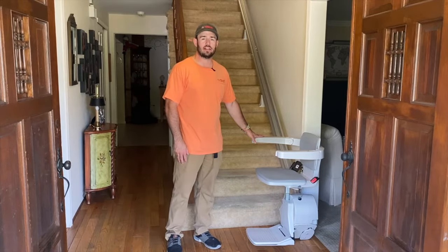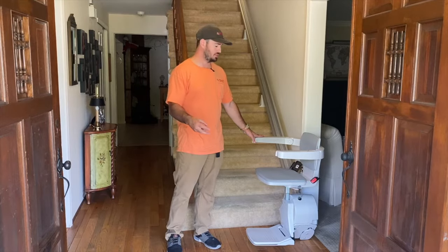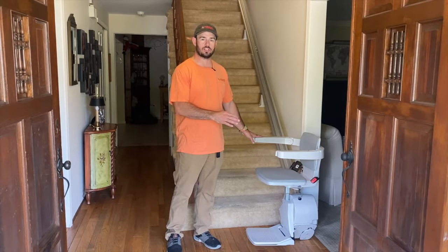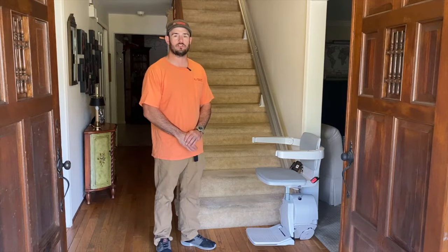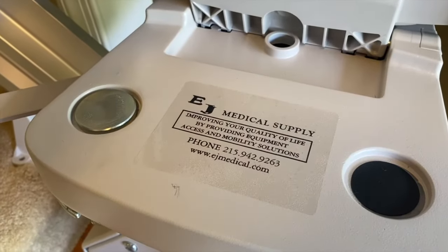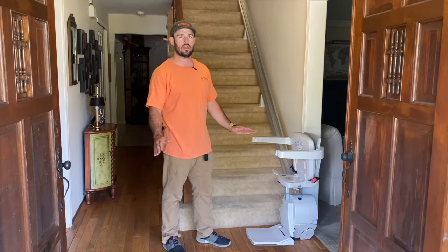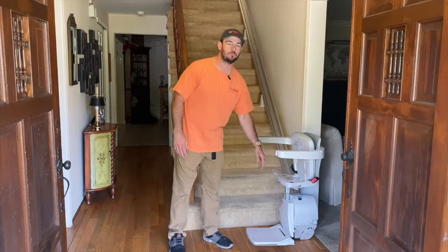With this stair lift there is a lifetime warranty on the major components, including the motor, transmission, track, and gear rack. If a part fails within your time of owning the stair lift, the part is fully covered. Anything installed within the first year — we fully cover the service of the stair lift. We put a big sticker right underneath the seat with our phone number on it, so if you ever have any questions or concerns, all you have to do is lift the seat up and give us a call.